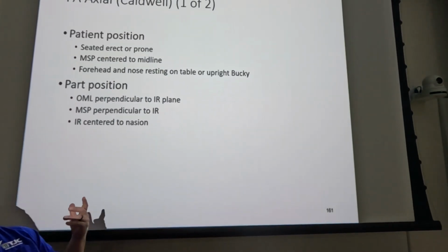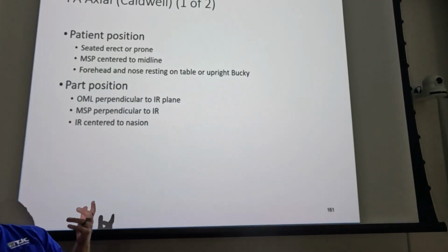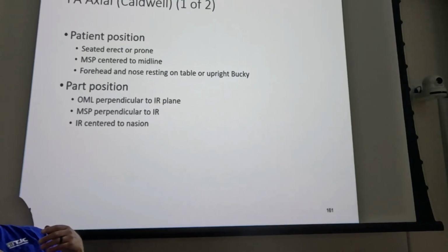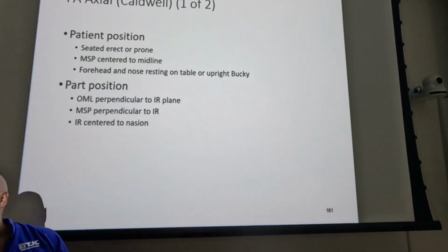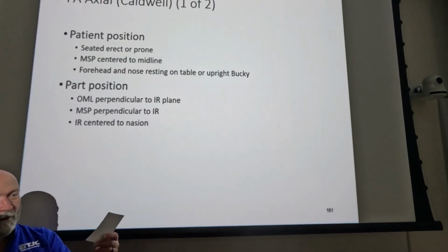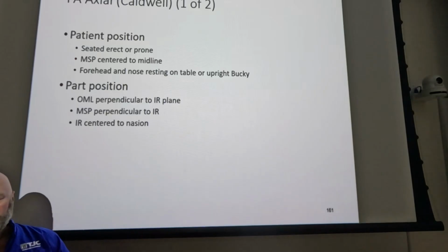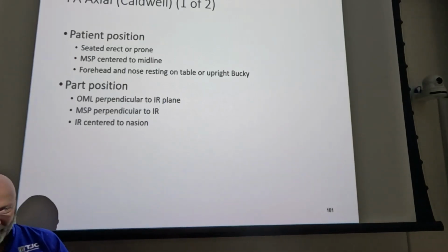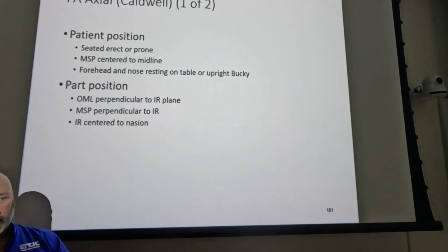So again, you'd have to oblique the patient's head 53 degrees, extend the chin 37 degrees, whatever. Do you have the protractors in clinicals to do all that? The answer is no. You probably have never seen one in clinicals. You might have seen one in lab, but you're not going to have that in clinicals.